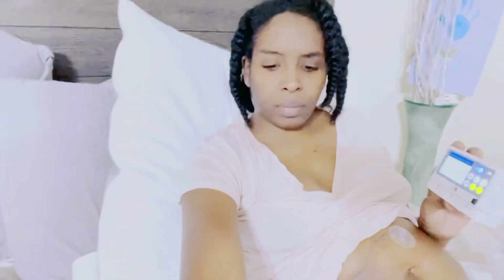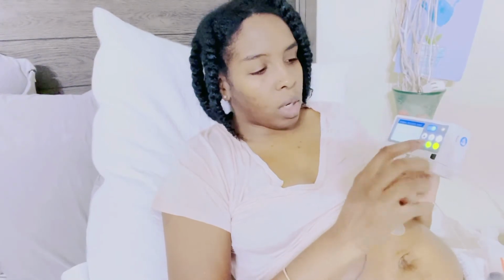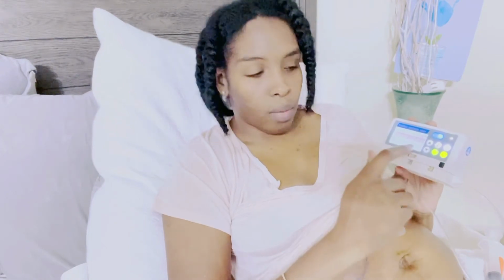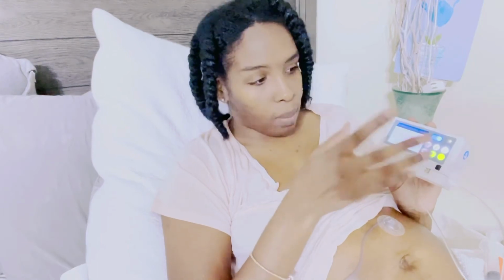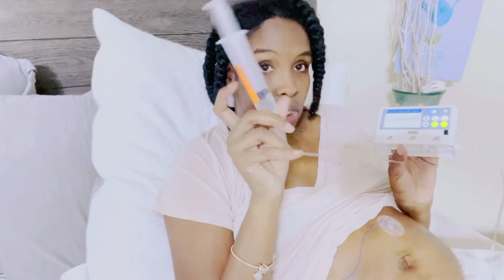Okay, I'm gonna have to hurry up. I have to hurry up because I'm feeling like I have to throw up. All right, so I'm gonna keep it on current RX, which is my current prescription. So press OK. I'm gonna resume the infusion because we've already started, and this has pretty much approximately the right amount of medication to infuse into my body for the remainder of this syringe.